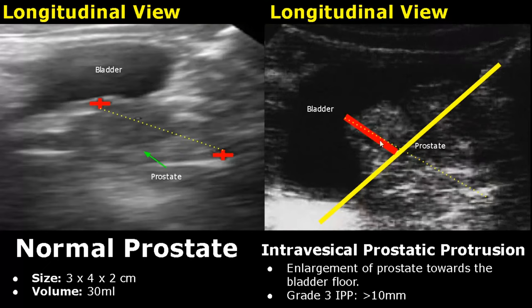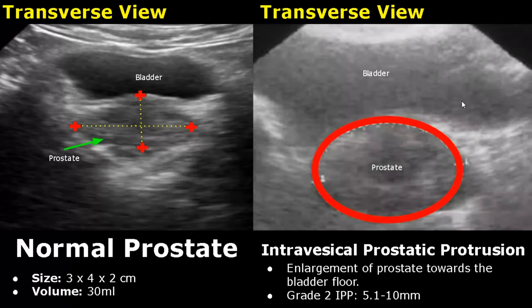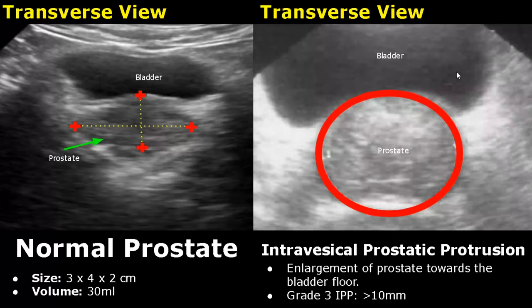Here we can see a very large prostate where the IPP is greater than 10 mm. This image is in transverse view — here is the bladder and this is the prostate. Grade 1 protrusion is very subtle, less than 5 mm. Moving on to grade 2 IPP, you can see a larger prostate gland. And finally, a grade 3 IPP — the protrusion is very large, greater than 10 mm.